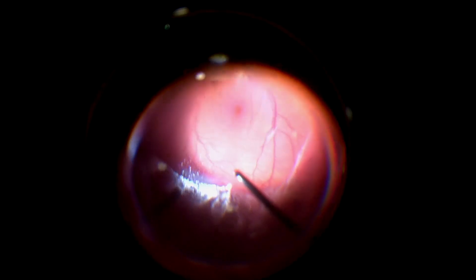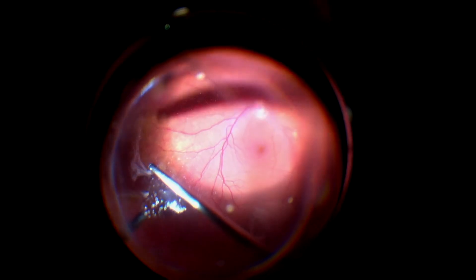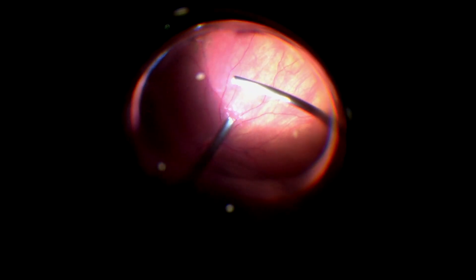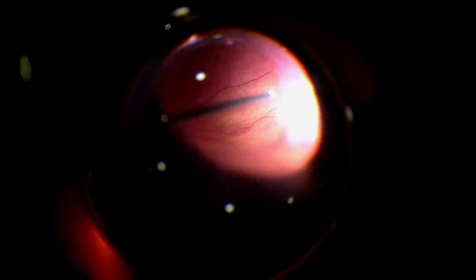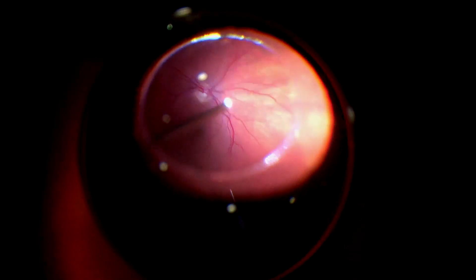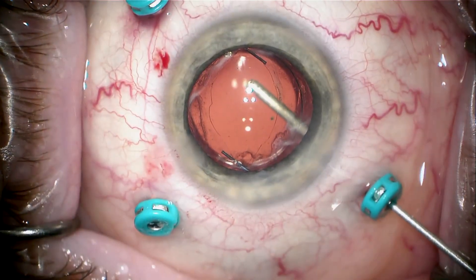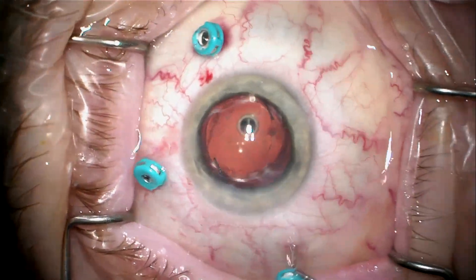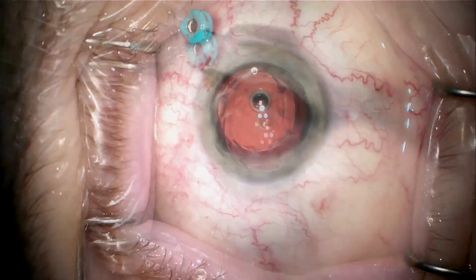You can see this very nicely coming up. I turn the cutter on and off as I do this, wanting to be as gentle as possible so I don't induce any retinal traction or tears. Once I've completed the central vitrectomy, I go out to the periphery and clean up the vitreous as far as I'm able to see. Then I perform scleral depression and inspect 360 degrees to make sure there are no holes or tears. I can then turn my attention back to the anterior segment — the vitrectomy is completed. I make sure there's no vitreous right up behind the lens, pull my trocars, and the case is completed. Thank you for your attention to this case.